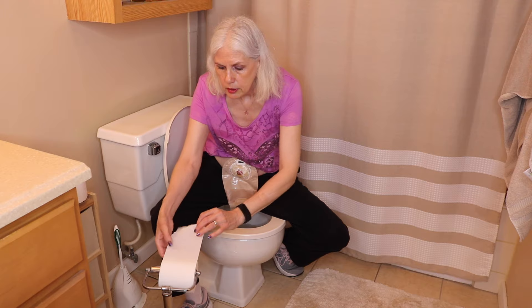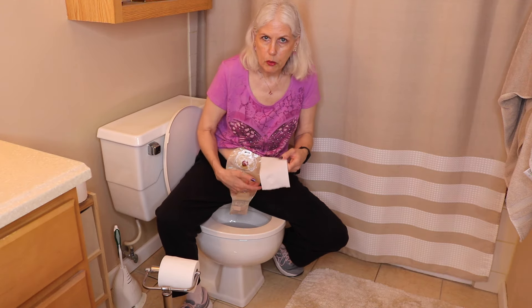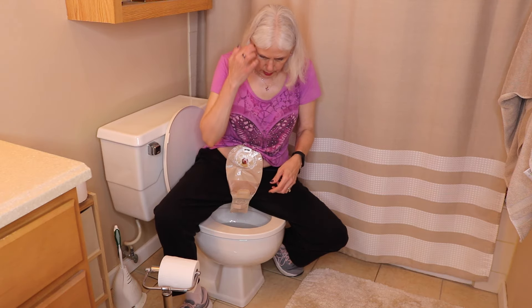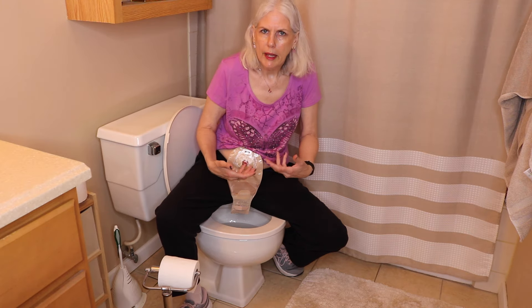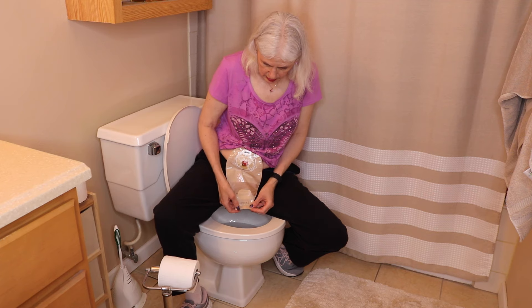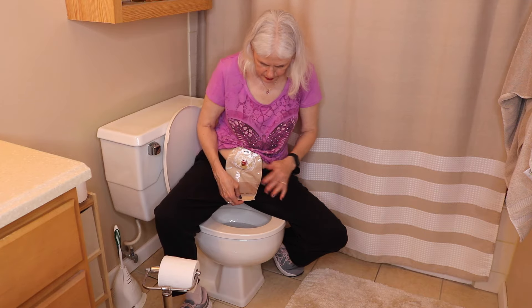Another thing you should do before all this — I forgot — is take some toilet paper, a couple of squares, and lay that in the toilet. Then try to aim for that when you're emptying your bag, so you don't have that splashing up at you. It'll help eliminate the splash somewhat.